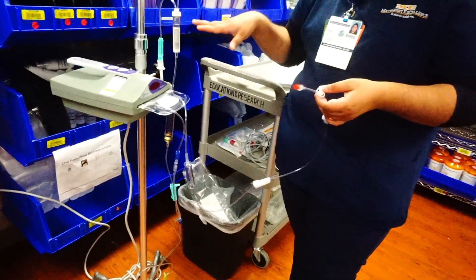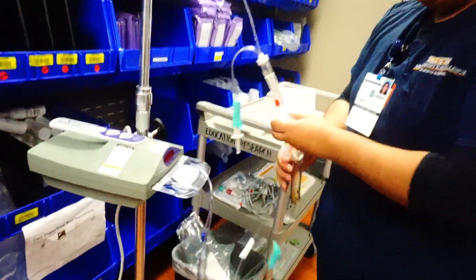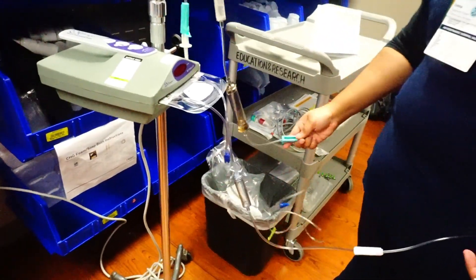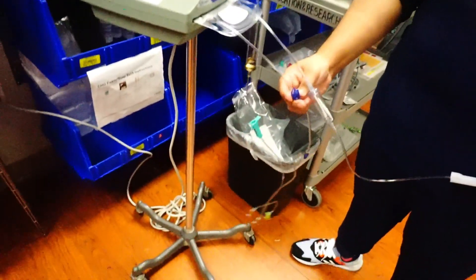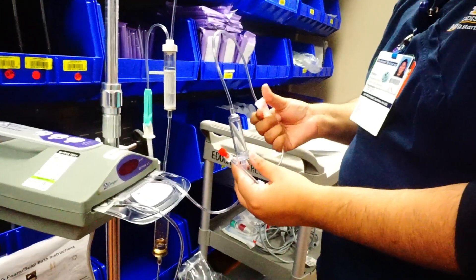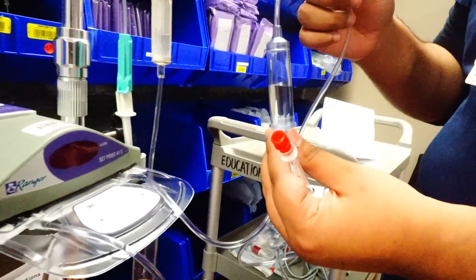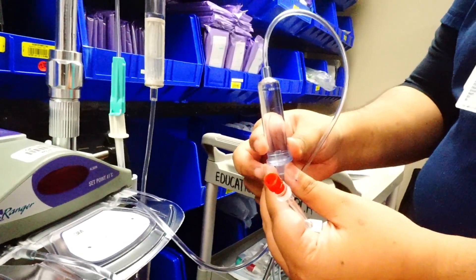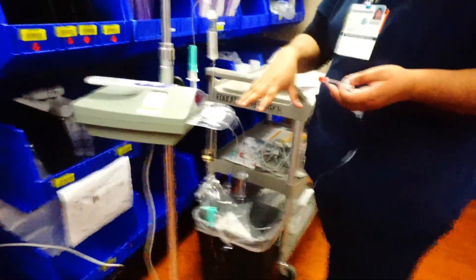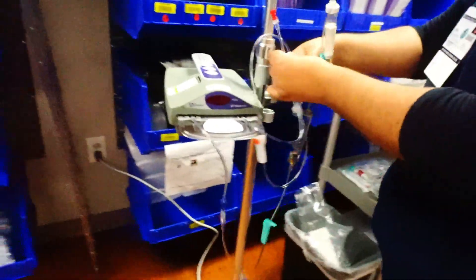At this point, go get your blood and do that whole verification process. When you come back and verify, we're going to prime this entire warming set — everything from the blue end onward is still full of air. We'll unclamp here at the blue end, hold this upside down, and make sure everything is unclamped — that's a big, important step. We let it go, air escapes, and we let the chamber fill all the way to the end, then clamp. Remember, this was all saline — don't prime with the blood, because if there happens to be air in there, you'd rather waste saline than waste blood. Then we can place the saline bag on the side in our little chamber.